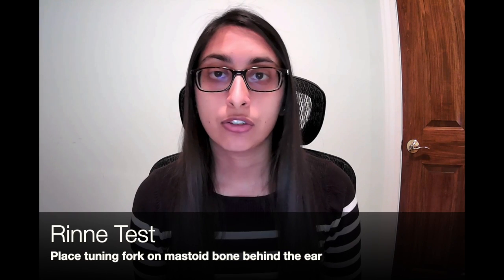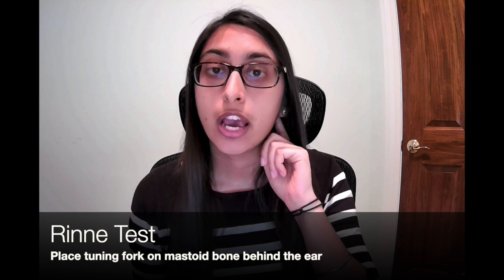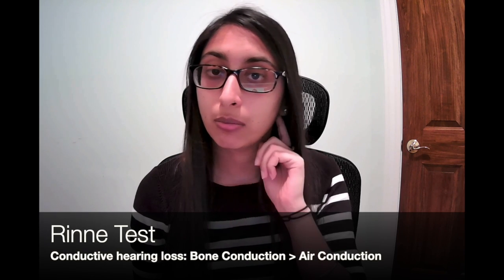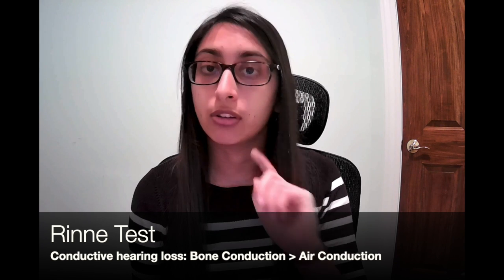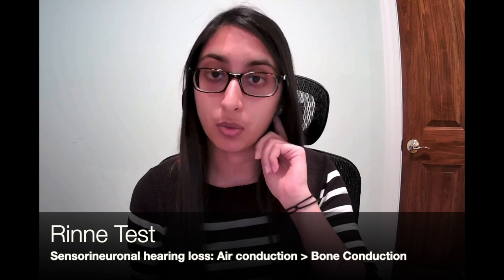For the Rinne test, you're going to take the tuning fork and place it on the mastoid bone behind their ear. And you're going to ask them when they stop hearing the noise. When that happens, you're going to take the tuning fork and hold it out here next to their ear. So you're testing air conduction and bone conduction with this. So a patient comes in and they have hearing loss in this ear, and I'm performing a Rinne test. If they have conductive hearing loss, then the bone conduction will sound better than the air conduction. If they have sensorineural hearing loss, the air conduction will sound better than the bone conduction.